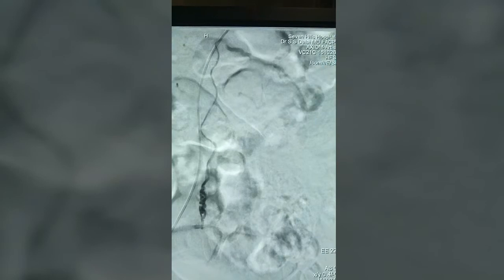So this is the origin of the vein, which is going all the way up, the thick one. So let's review the angiogram again at the start of the anterior spinal artery, the fistula and the vein. So this is how it looks.